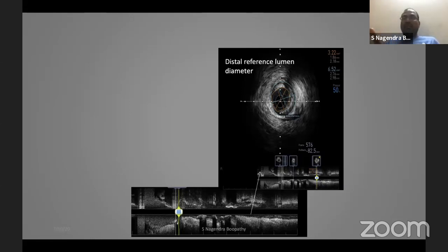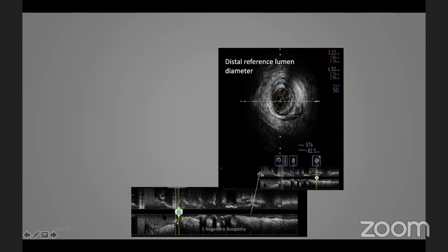One stent was available, but that has been taken out of the market. The longest stent available at present is 48 millimeters. Even if it is going to be a 38 millimeter lesion length, there's no stent that can go from 2.5 to 4 without losing its architecture. So 100% I'm going to take a two-stent strategy here, I mean two long overlapping stents. To conclude, along with rotablation with two burrs, a 1.25 burr here and a 1.75 burr here. With the 1.75 burr, I will not go all the way here. I will just ablate the distal left main to LAD. So two burrs.